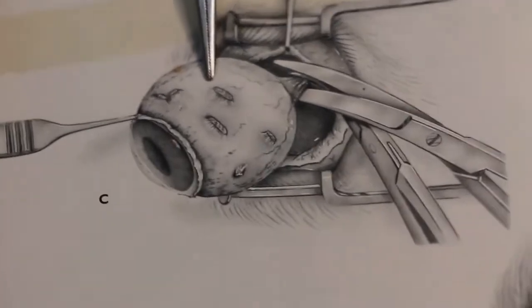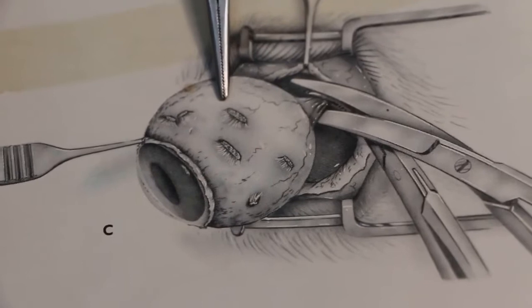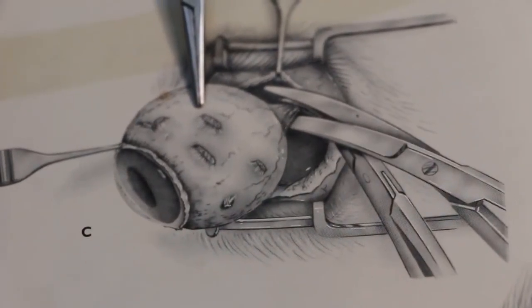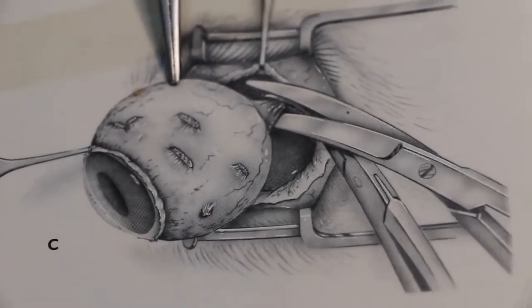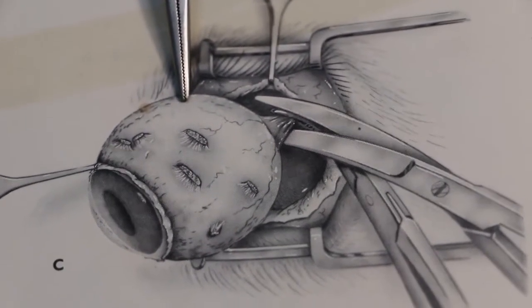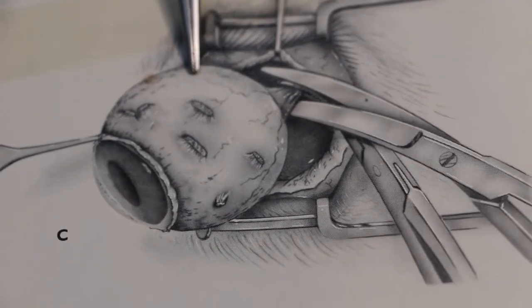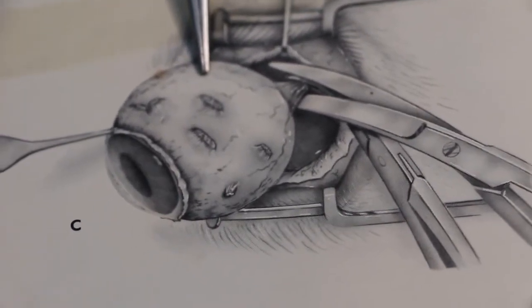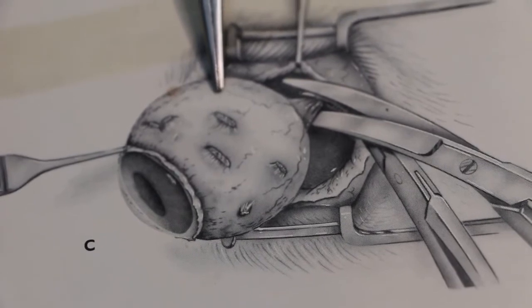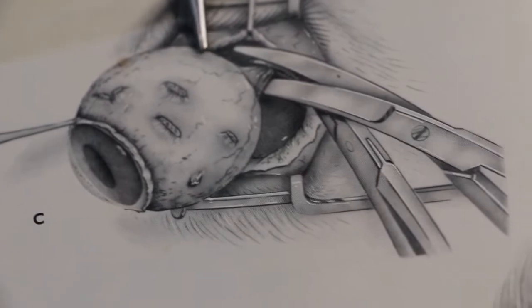Then the third part will be slowly cutting off the muscles all around the globe, so that the whole eyeball can be pulled out a bit, but not too hard and too forcefully. Otherwise, it affects the optic nerve and the other eye as well, the eyesight. So this is the third part. I use electrosurgery and I slowly dissect out the eyeball all around 360 degrees.